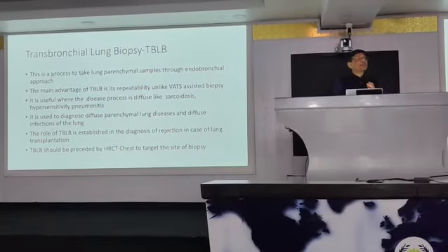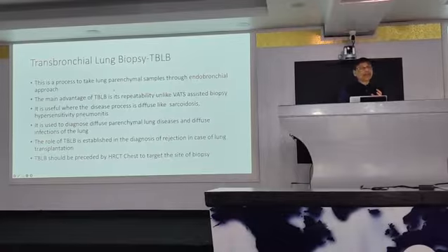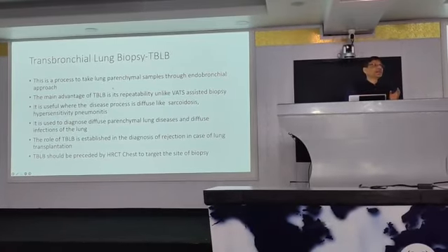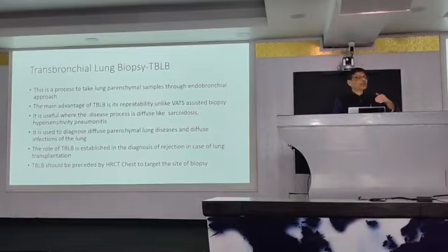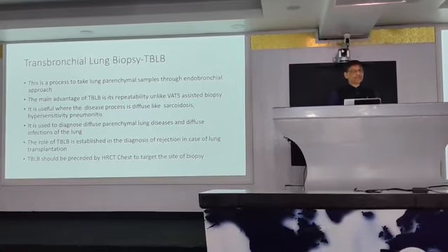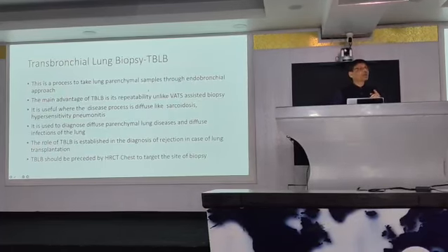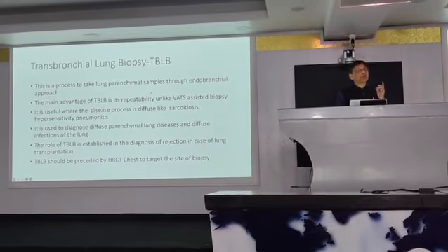Transbronchial lung biopsy. What is this? This is a process to take lung parenchymal samples through the endobronchial approach. One is the transthoracic approach to take lung biopsy, which surgeons usually do. Nowadays pulmonologists are also doing this through thoracoscopy. But this is the endobronchial approach. We are doing this with the help of a bronchoscope.